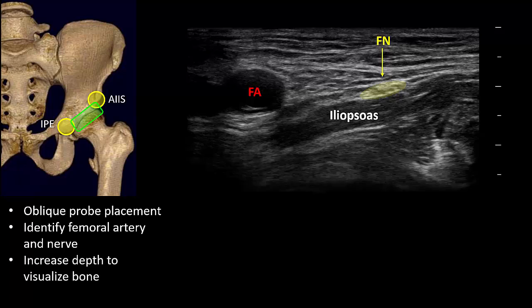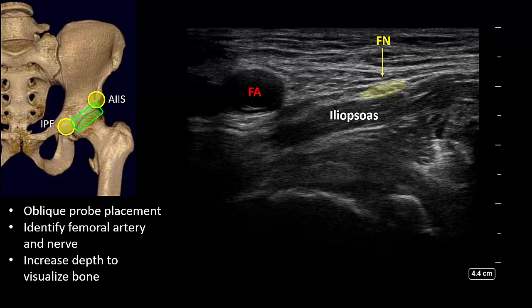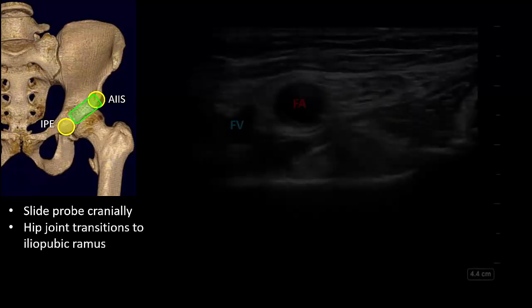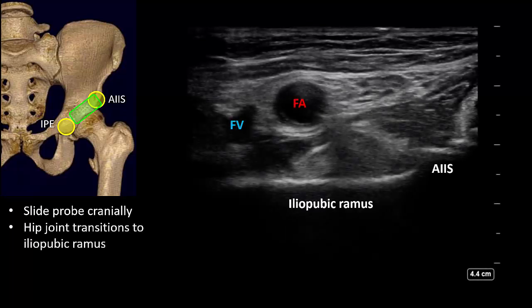Increase the depth as needed to visualize the hyperechoic line of the underlying bone. If this line has a curved appearance, it represents the femoral head in the hip joint. If this is seen, slide the probe in a cranial direction. The curved line of the hip joint will transition into a flat line that represents the iliopubic ramus. The anterior inferior iliac spine is often seen as a prominence at the lateral end. The iliopubic eminence lies at the medial end, but with a linear probe it is often not possible to see both in the same view.